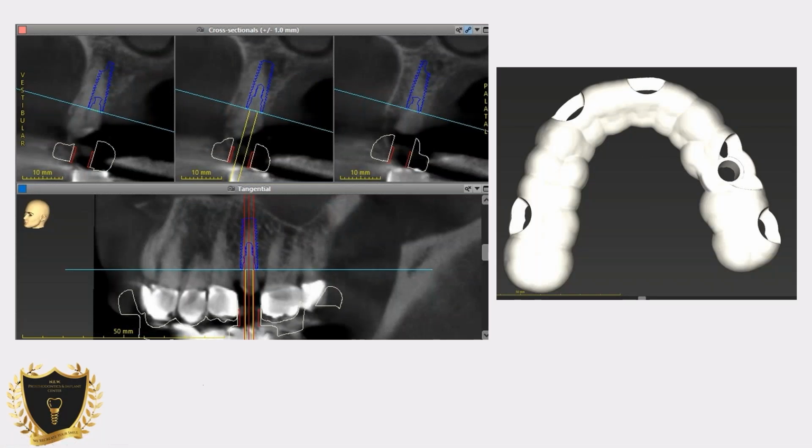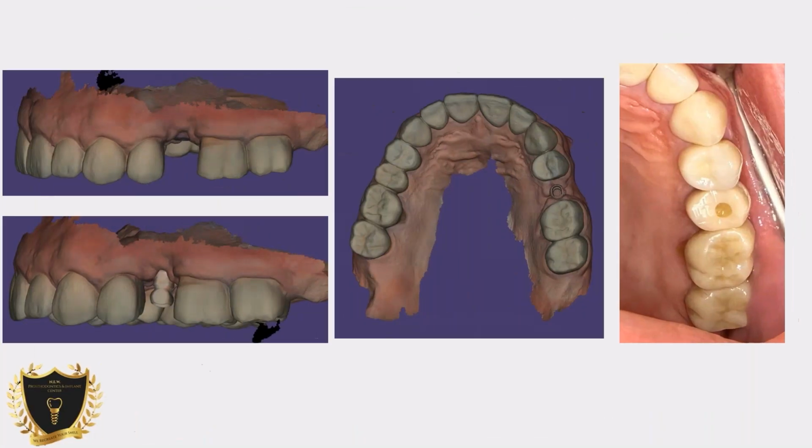If you can place an implant and achieve stability, the plan would be to place the implant immediately, but not load it, for the obvious reason. We have an implant in the native bone, but we may not be able to load it because of the risk of occlusal loading. This is a guide on the right, again in coDiagnostiX software. These pictures on the left show after healing, a scan body in place, and this is the final restoration. You can see the access hole coming from dead center. Everything looks good, with exactly the same proportions as the adjacent teeth.